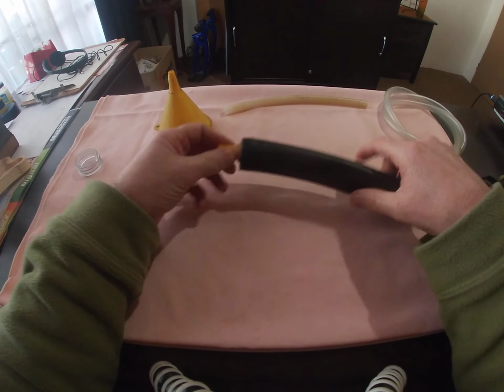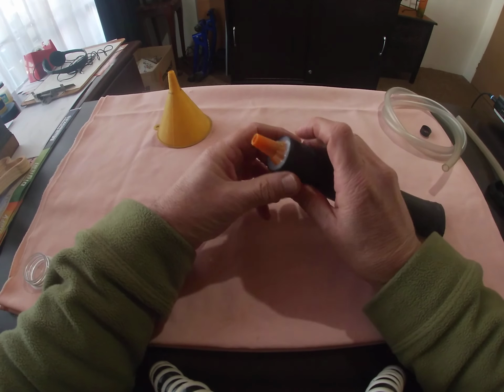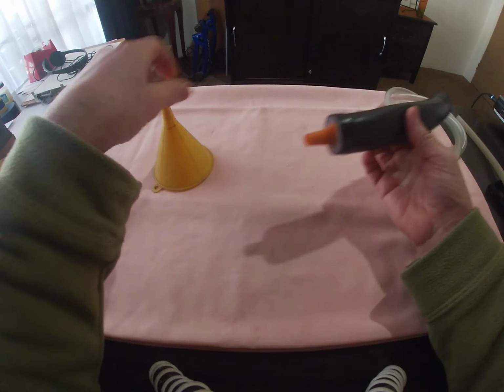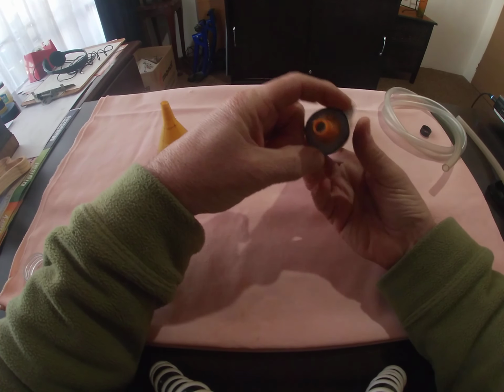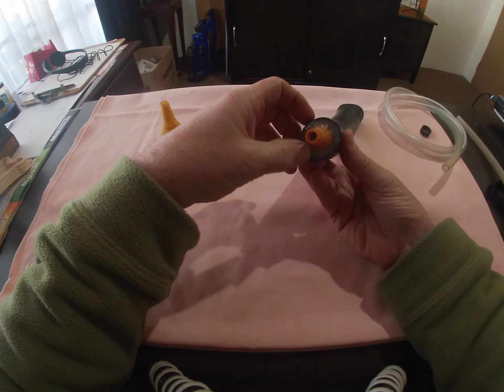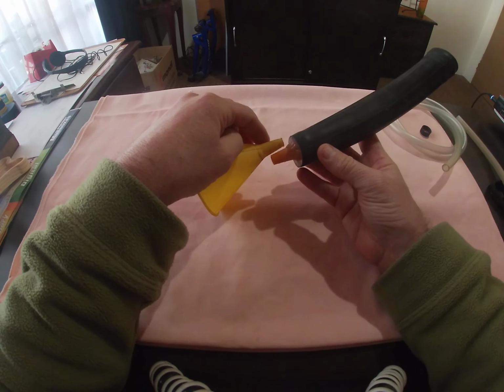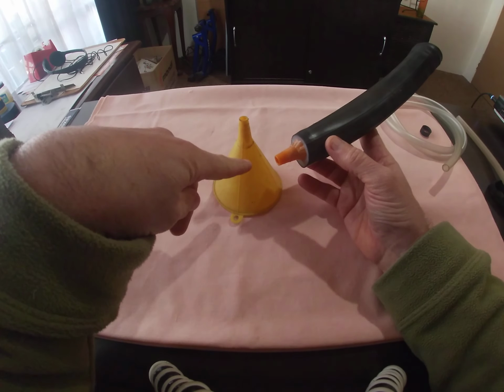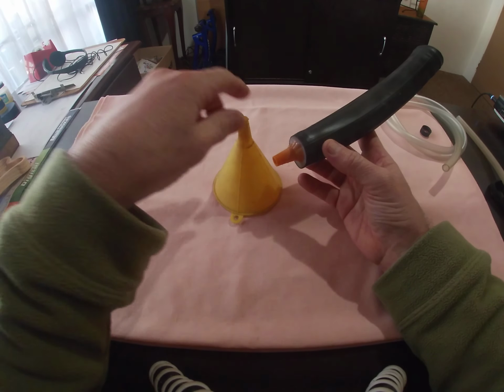The first thing is you start with a funnel part, and you're going to have to measure it to the width of this, because as you can see, I cut it down so it would go in snug in here, so it doesn't pull out easily. That really helps to hold it in place while you hot melt it together. I would say leave the length of the funnel as it is. Don't cut it off yet. I cut this one off too early, but luckily it was still fine. So you'll probably cut it a little bit bigger, then try to fit it, and then make it smaller till it fits real tight.